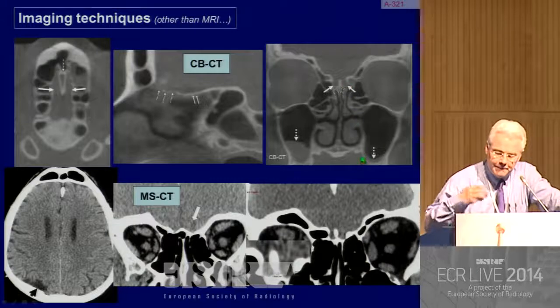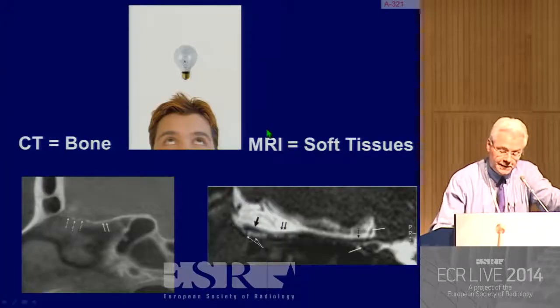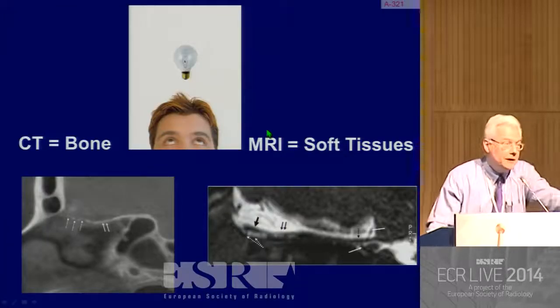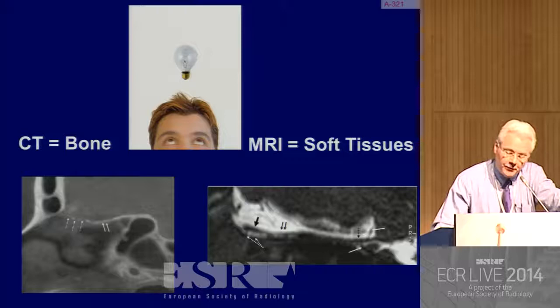These X-ray methods give information about bone. This is not a surprise. If you are looking at bone information, you will use CT modality, but of course MRI will be preferred because of its higher and best soft tissue contrast.